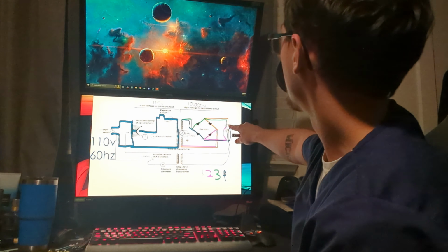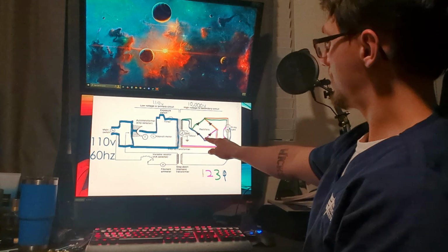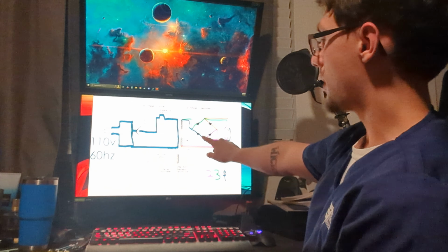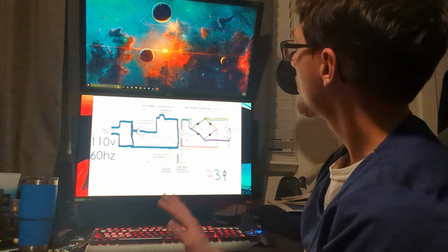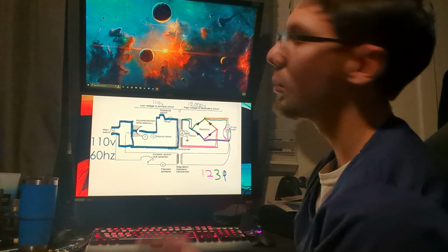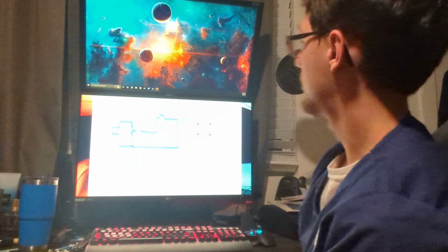And then lastly, we'll have our blue line, which comes out from the anode side of the tube, over to the left, and then diagonal to the left, again through the passable side of the diode, over to the coils, okay? So it's a bit convoluted, but important thing to note here is that there's going to be 4 diodes, 4 points of rectification, and that you can only pass the diodes in one direction.